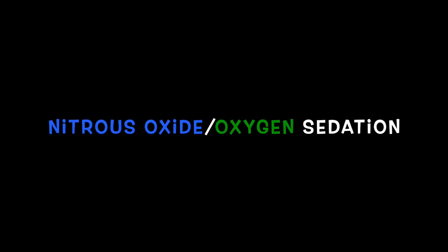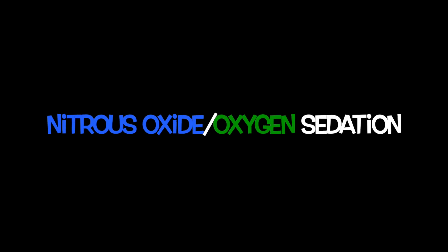In this video we will demonstrate how to properly administer and terminate nitrous oxide oxygen sedation. To begin, let's review the components of the nitrous oxide sedation unit.